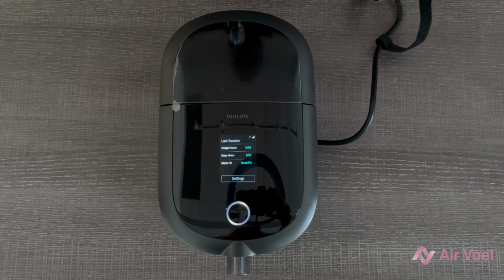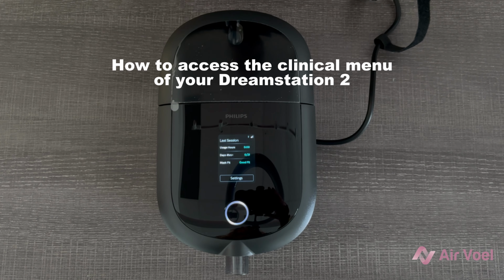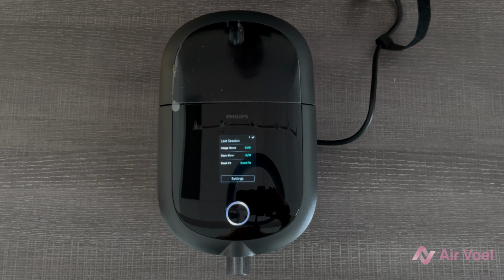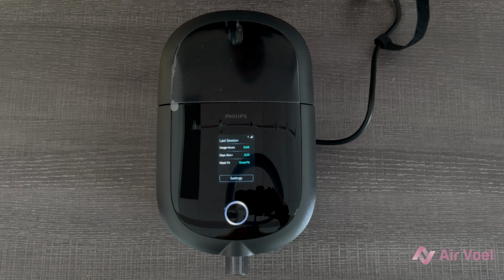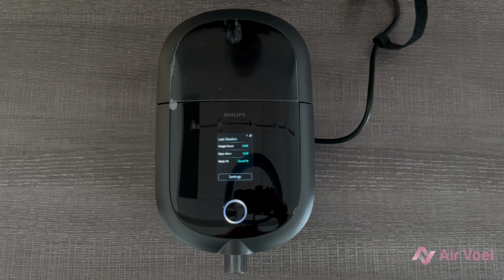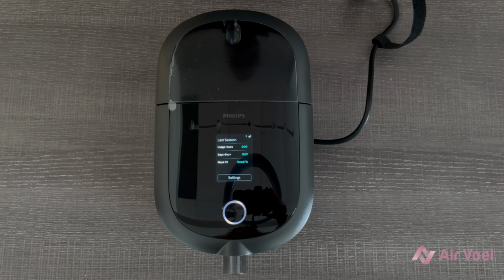And in today's video, I'm going to show you how to enter the clinical menu of your DreamStation 2 APAP device. Now, the method to enter the clinical menu would be the same if you have a DreamStation CPAP or also a bi-level device. I just have an APAP here for this example.